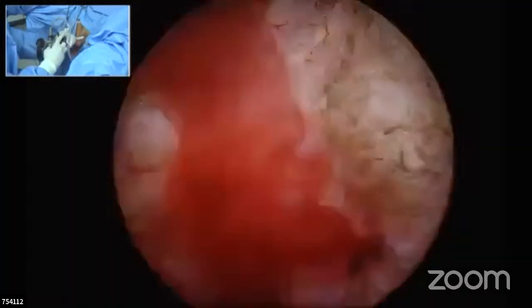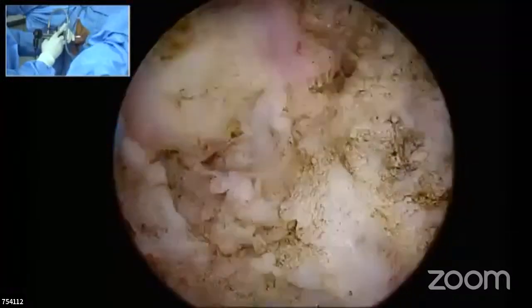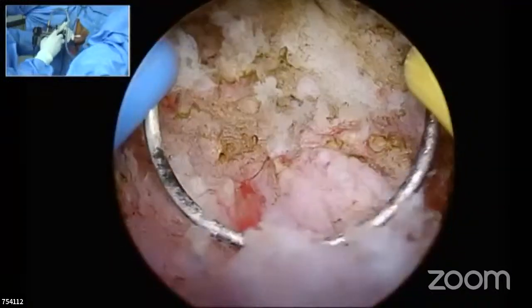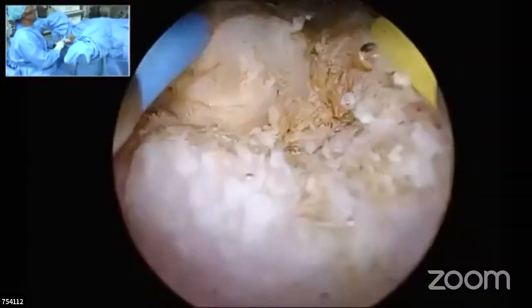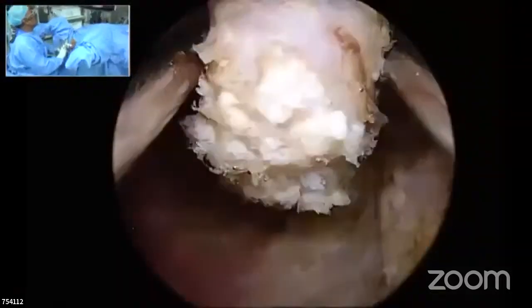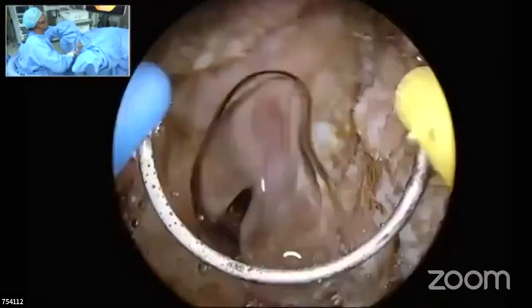You see, experts, especially people who have done monopolar for years, have fantastic control, like pointed coagulation, leaving the rest of the things. If you do that sort of thing, even monopolar is essential. I don't think the results will be any different between bipolar and monopolar. The way to cut and the way to create is the only thing which matters. That's all. But coagulation definitely is much better with bipolar, sir.